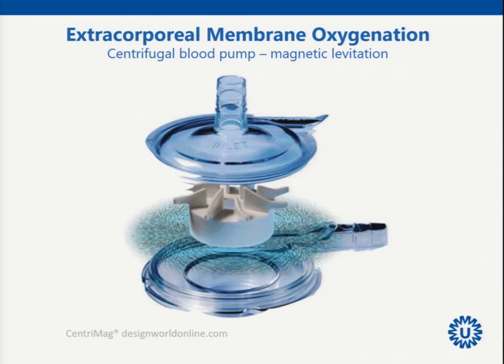So it's actually held without any bearing within the magnetic field. So it's not in contact with any material, not with any bearing or any other form. So that makes it contactless when it comes to blood trauma. You can imagine that if it's within the magnetic field, not only turned, but also levitated, the blood trauma is minimal and it cannot warm up as in a bearing. Yeah, is that clear?